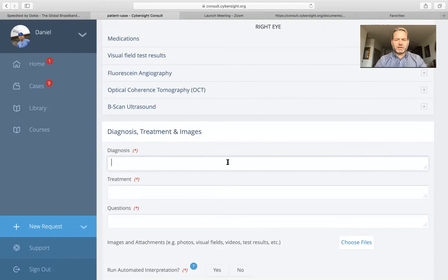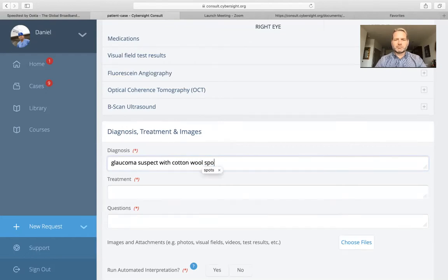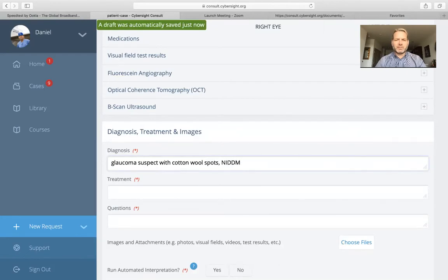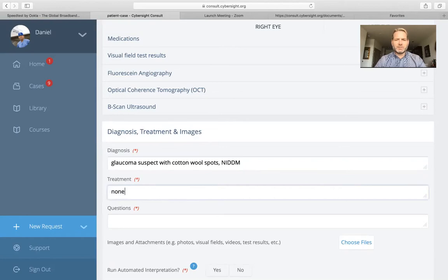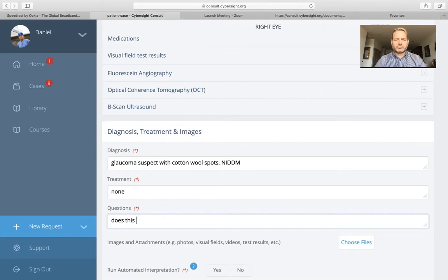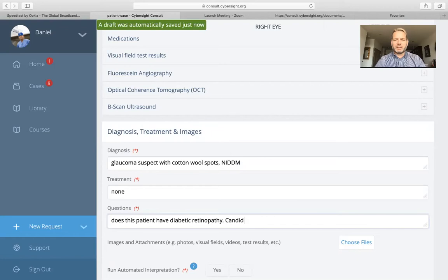For our diagnosis, we have glaucoma suspect with cotton wool spots and non-insulin-dependent diabetes. Treatment: none so far. And our question will be: does this patient have diabetic retinopathy, and are they a candidate for laser or Avastin?